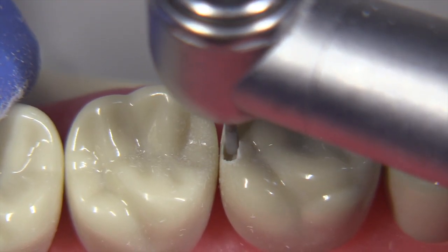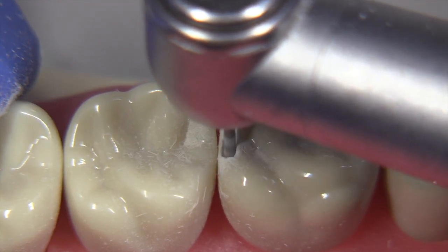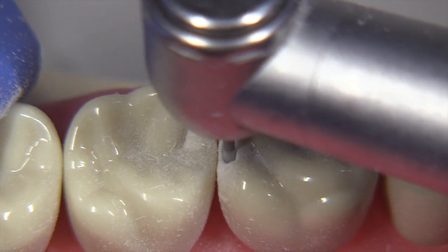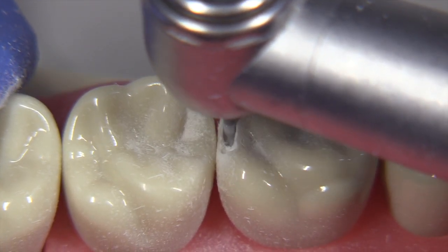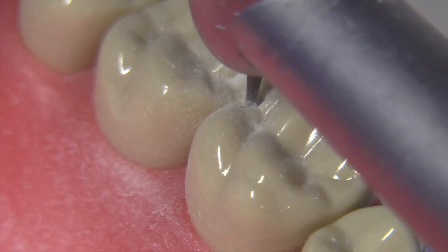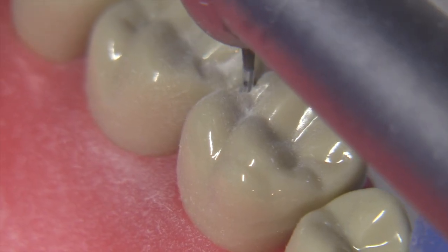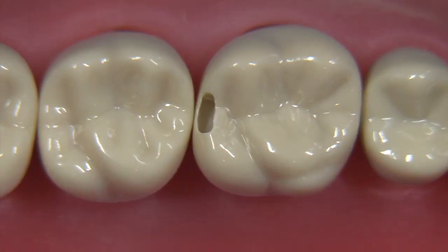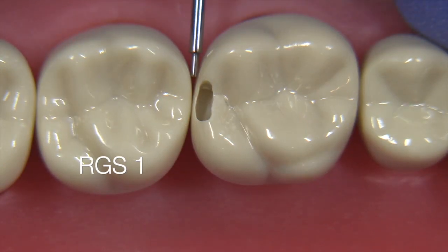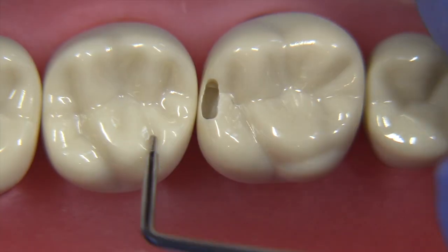Rather than putting the bur all the way at the bottom and trying to push all at once - this is one of the great mistakes that I see novice operators do, and even sometimes more experienced operators, because the bur is trying to engage a lot of tooth structure and you can make a lot of mistakes. By just chipping away at it from the top down it's actually quite safe and you have a lot of control. We can use an RGS1 to get an idea of what kind of extension we need.